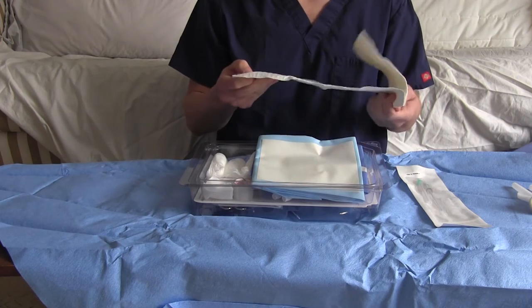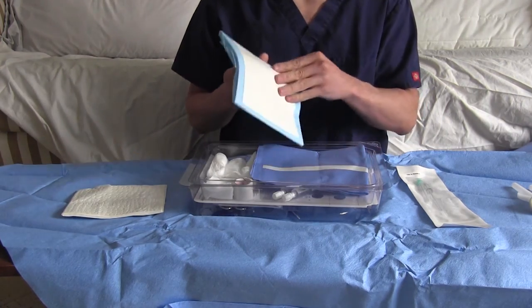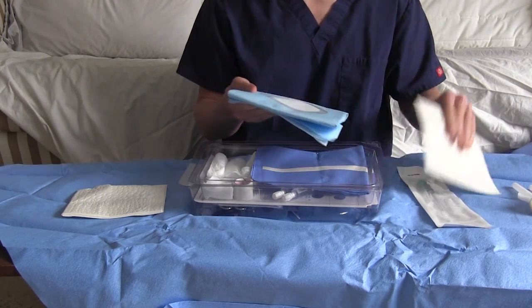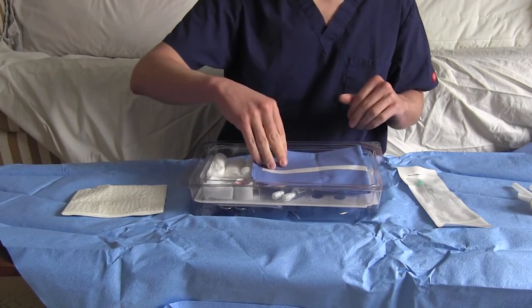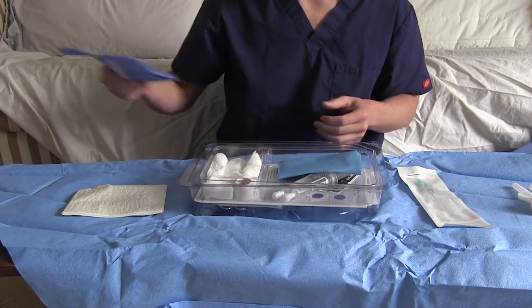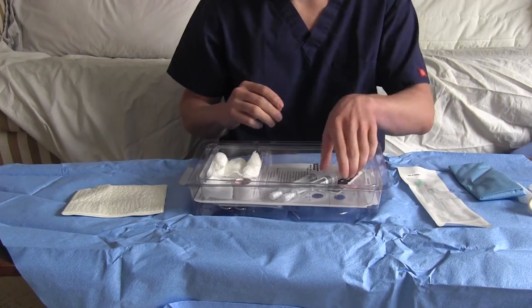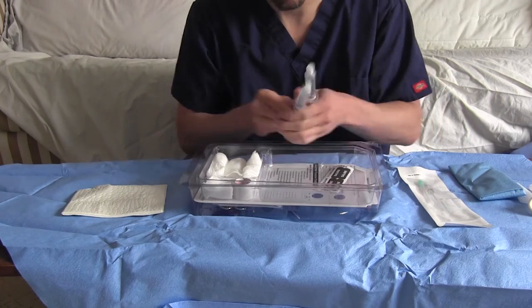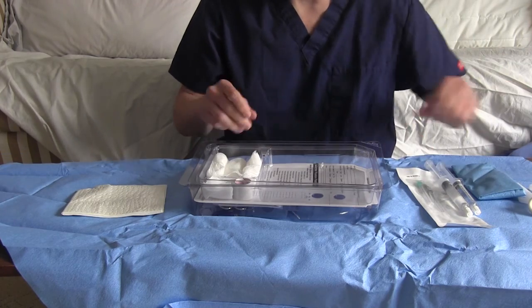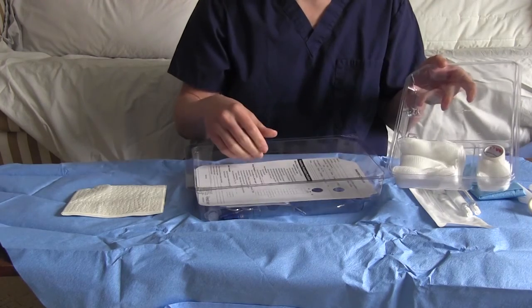You have this kind of towel, I guess if you wash your hands. And then you have the actual fenestrated drape you're going to put on the site. We're going to save that. You have additional drape if you have to cover up more of the arm that's not covered. Ultrasound probe cover. 2 flushes. You'll see those in a sec. You can label your flushes and your lidocaine. We'll put that aside. And 4x4s and some tape.